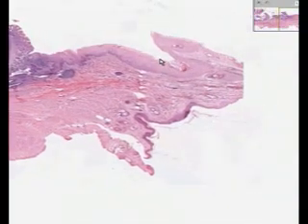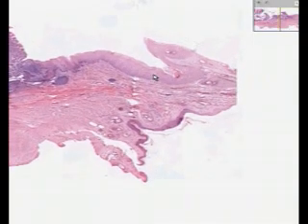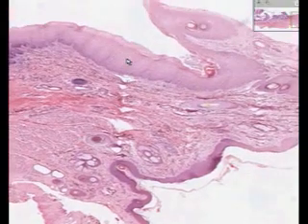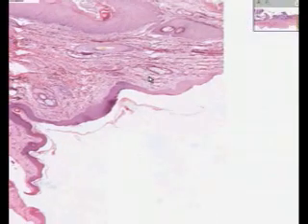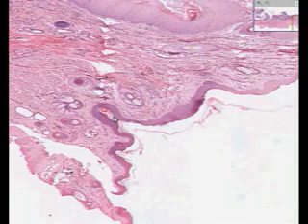Also notice that it is not very long after you get the squamocolumnar junction, then you get much more than just stratified squamous mucosa. You get keratinized stratified squamous mucosa with skin appendages, which is the definition of skin.